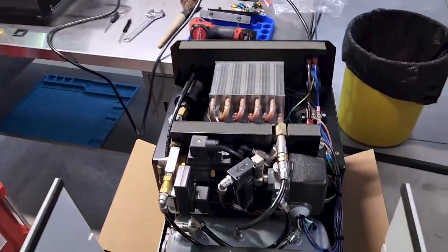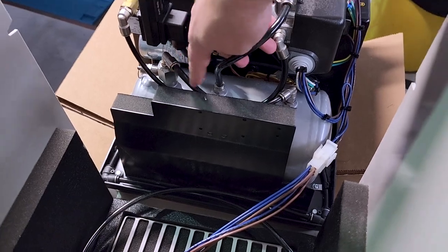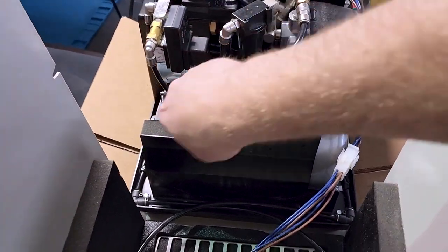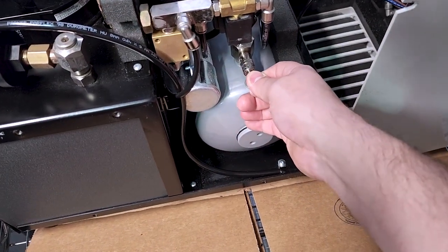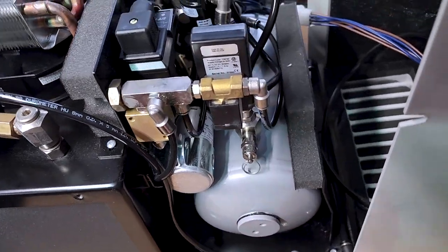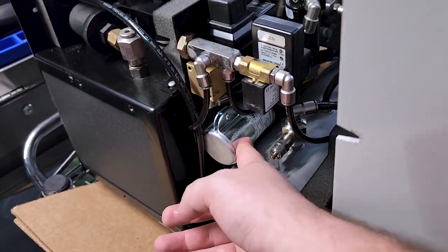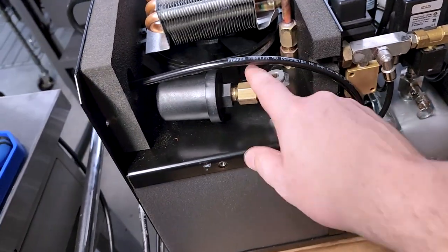For medical air you want to be as dry as possible. So here you have a purge. This guy here will come up to one of these guys. So it will purge, and you have your safety valve right here, which you see I'm pulling on it. There's nothing going on there. You have a motor start run capacitor. I like how it's nice and accessible right here on the side. Very good. And over here, this is your input.